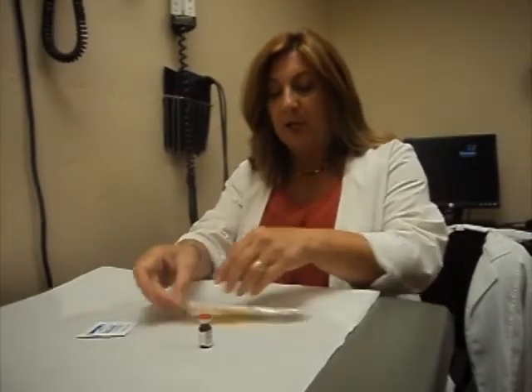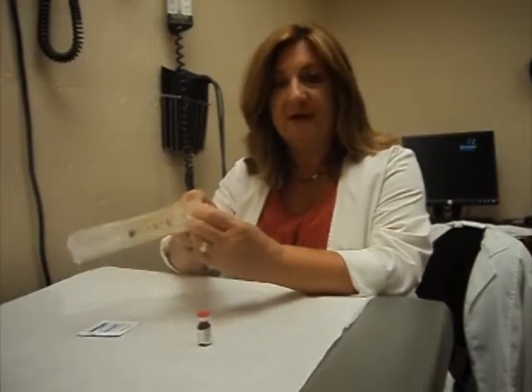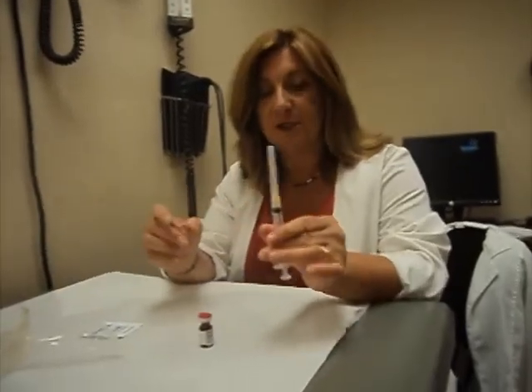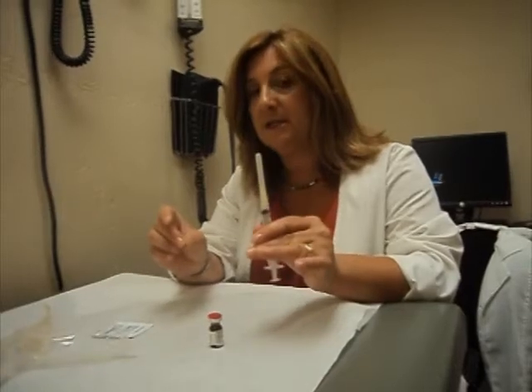Step 1 is to draw up the medication. If you're inexperienced, this may be a little tricky, but with practice you'll get it down. Syringes open with a split packaging, so you find the split ends and just pull them apart and hold the syringe. Now once you've started this step, you want to keep everything clean.